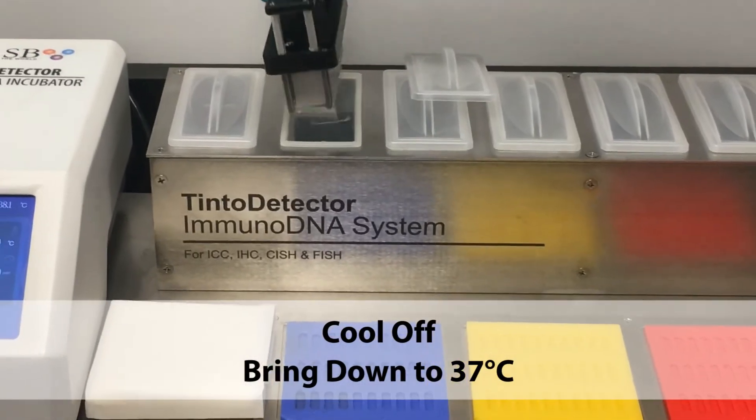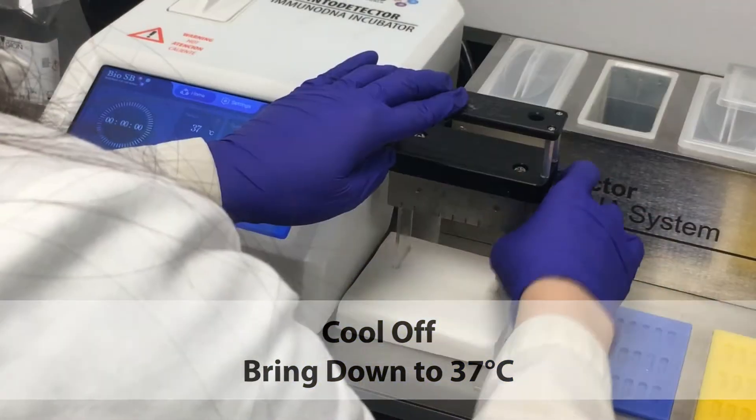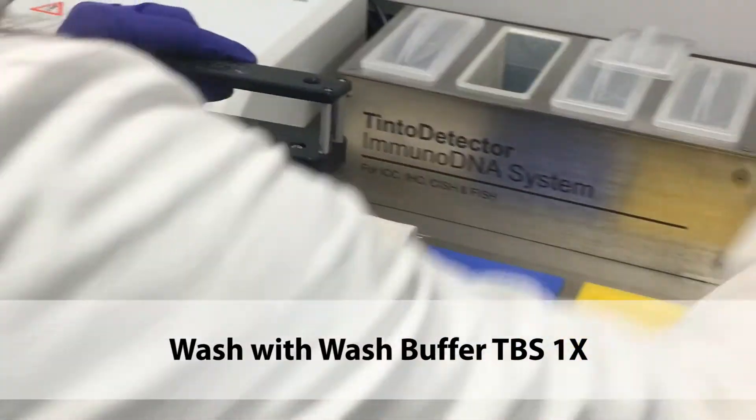Let the slides cool off to around 37 degrees Celsius, then wash with wash buffer.